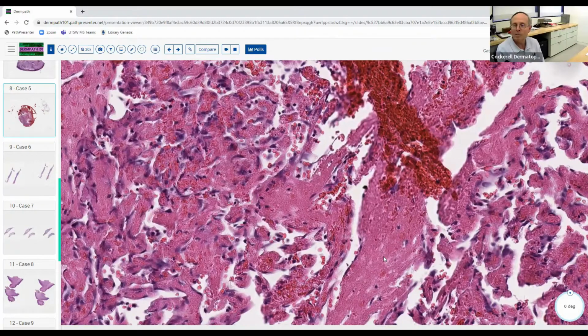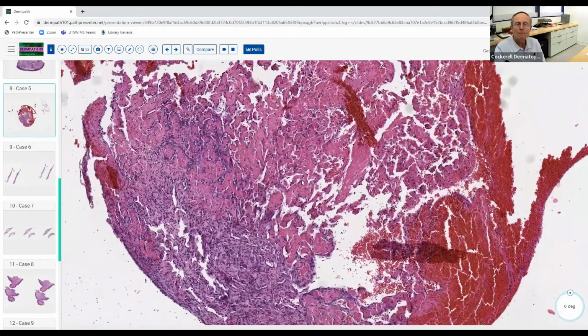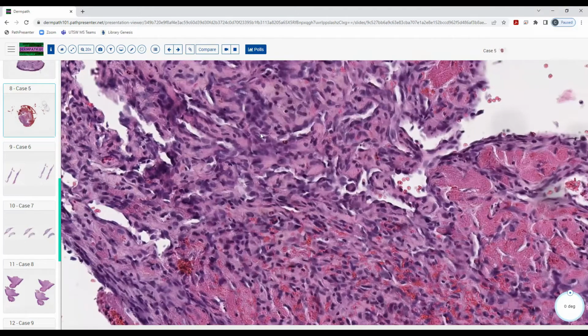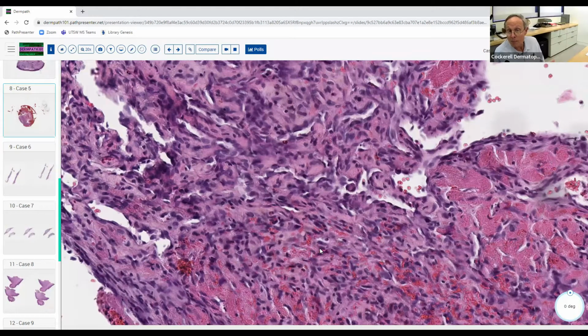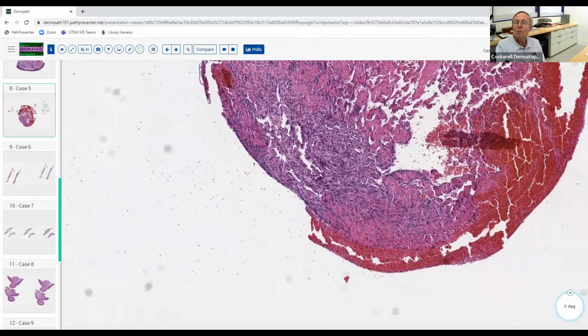Almost certainly it's fibrin. And then you've got these blood vessels, these endothelial cells, and maybe even some fibroblasts coming in here. In this area, what does this area look like? This also looks like blood vessels, more like interconnecting granulation tissue here. So we've got some granulation tissue, some hemorrhage, some fibrin, some endothelial cells, some fibroblasts. So what do we think is going on here?